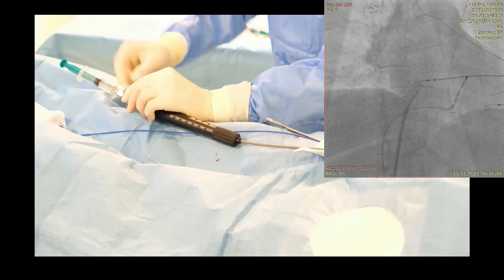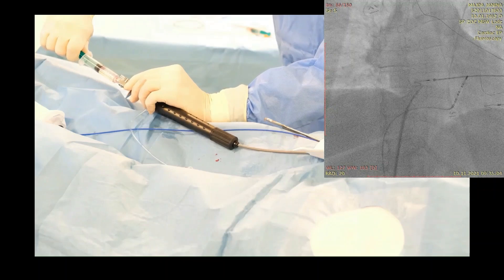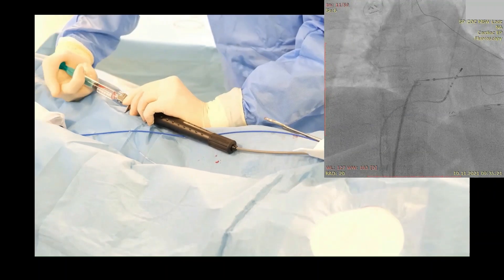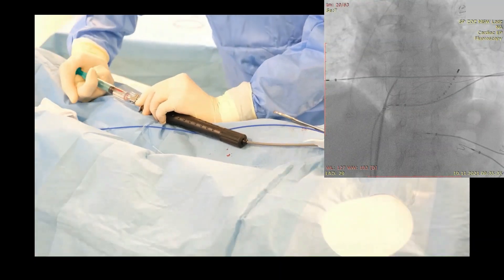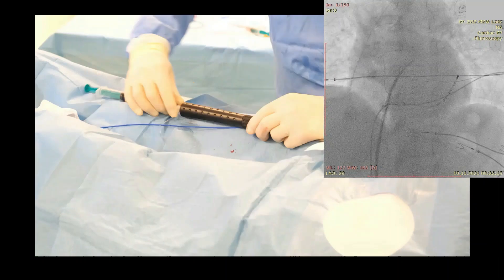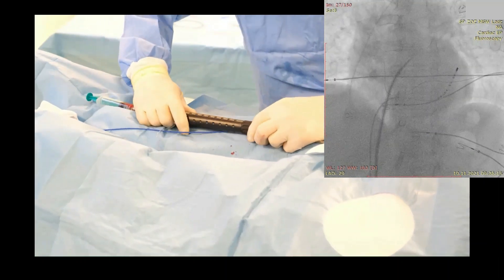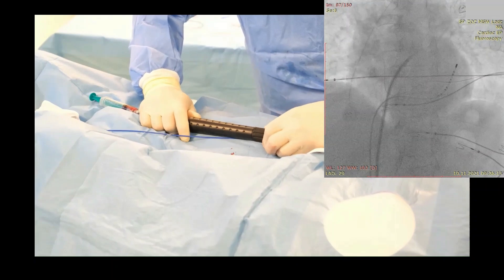Aspirate. Confirm the position of the needle by injecting contrast in multiple projections. Advance the assembly. Disconnect the sheath from the dilator and slide it over the dilator into the left atrium.